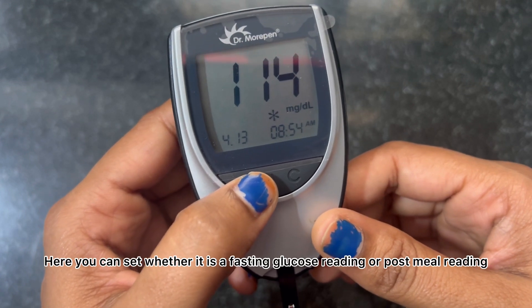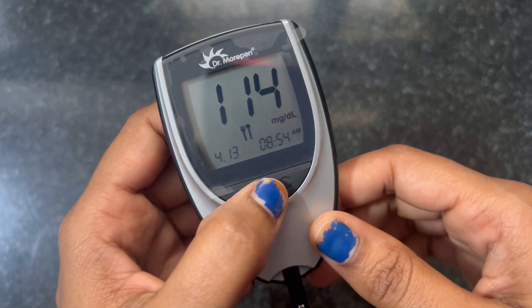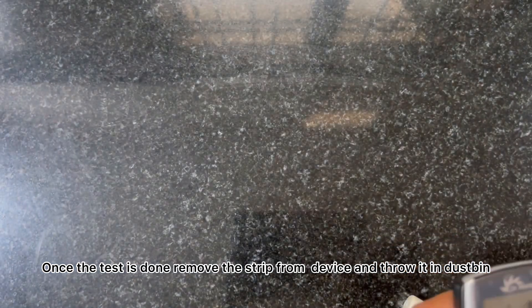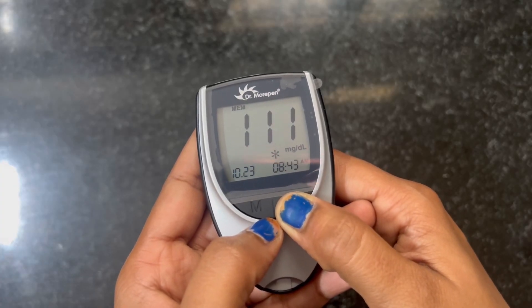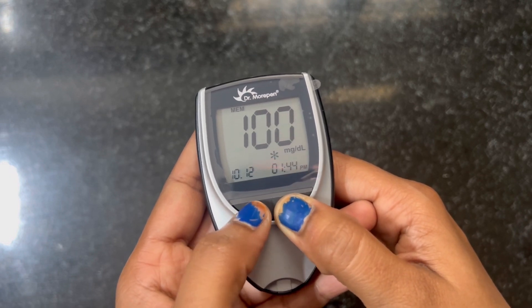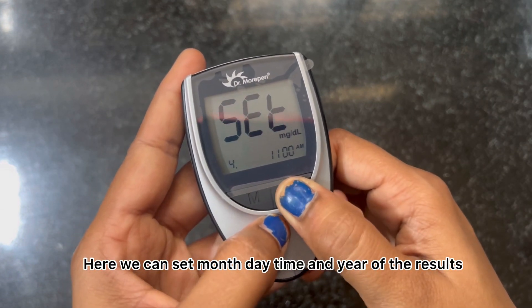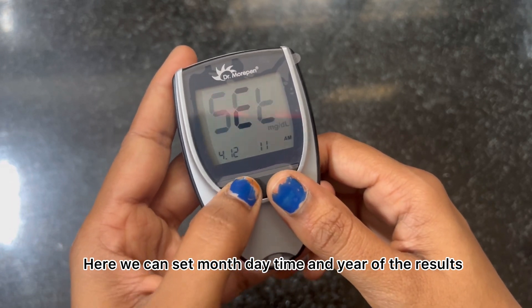Here you can set whether it is a fasting glucose reading or a post-meal reading. Once the test is done, remove the strip from the device and throw it in the dustbin. This device can store up to 300 results, and you can set the month, day, time, and year for each result.